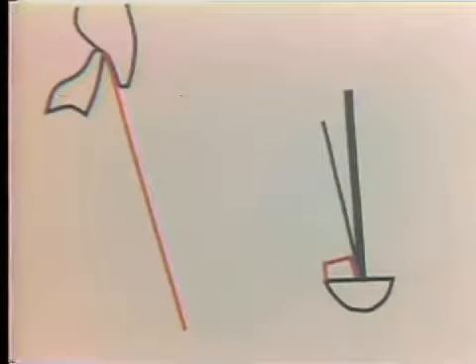So the stone casts will now not abrade. They will not lose the vertical dimension, and we can go through any dental procedure moving the casts over each other without worrying about loss of vertical dimension due to abrasion.